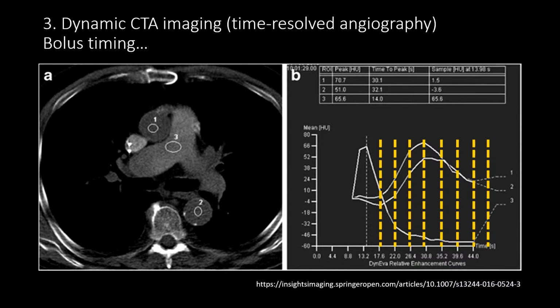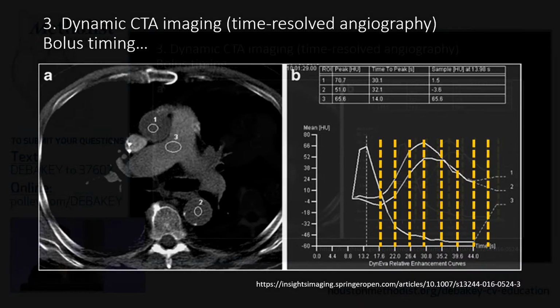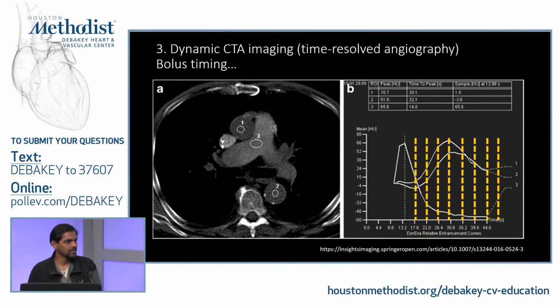So what we try to do is prioritize what information you need, especially in a case like aortic dissection, where the priority is having temporal information. So we tend to compromise on the image quality. You don't need a pretty picture for a fancy competition, we just need enough resolution to resolve the entry tears, but at the same time have the dynamic images.